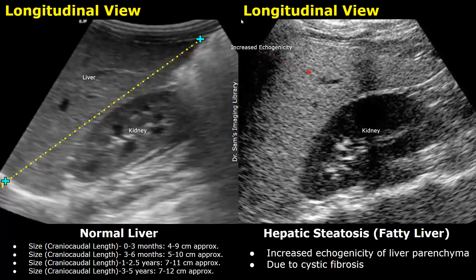Here is another case of fatty liver in a child due to cystic fibrosis. Increased echogenicity of the liver parenchyma is seen.